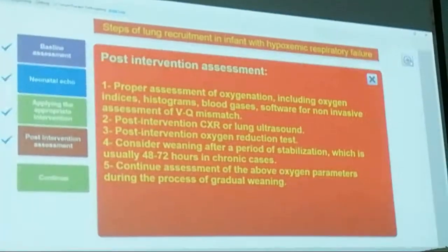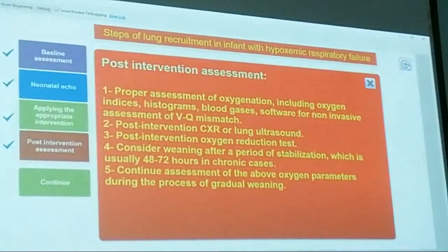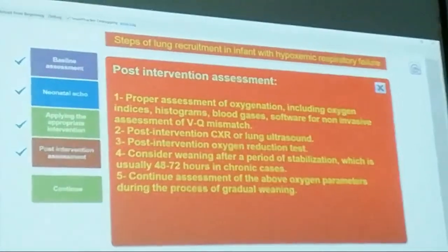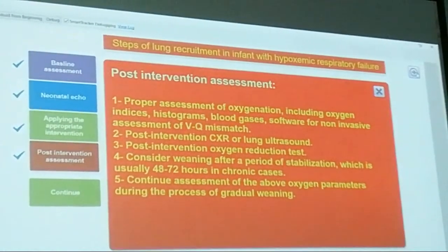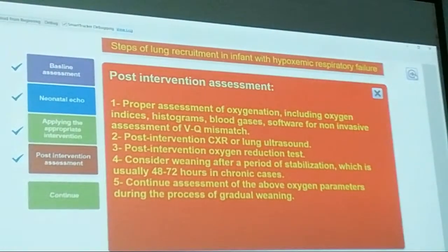Post-intervention assessment should include the following. 1. Proper assessment of oxygenation, including oxygen indices, histograms, blood gases, and we have explained how to use the software for non-invasive assessment of VQ mismatch. 2. Post-intervention chest X-ray or lung ultrasound. 3. Post-intervention oxygen reduction test.